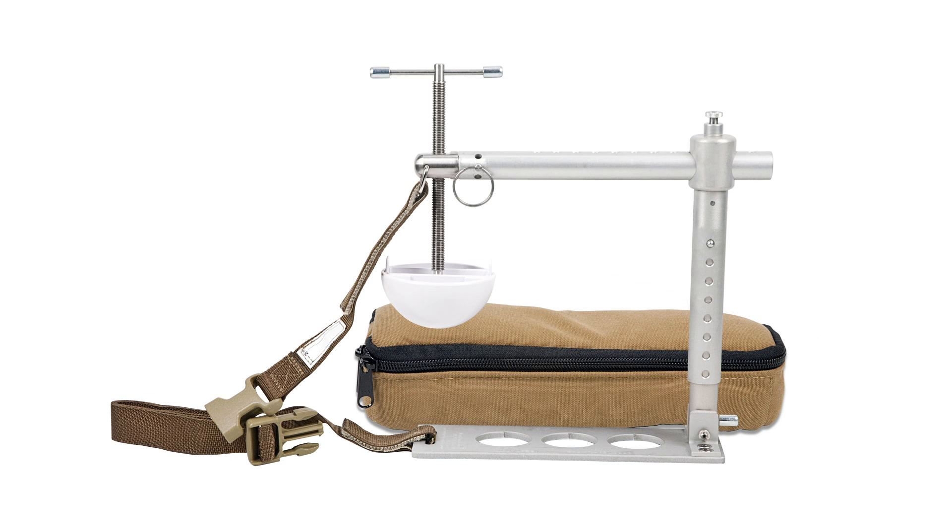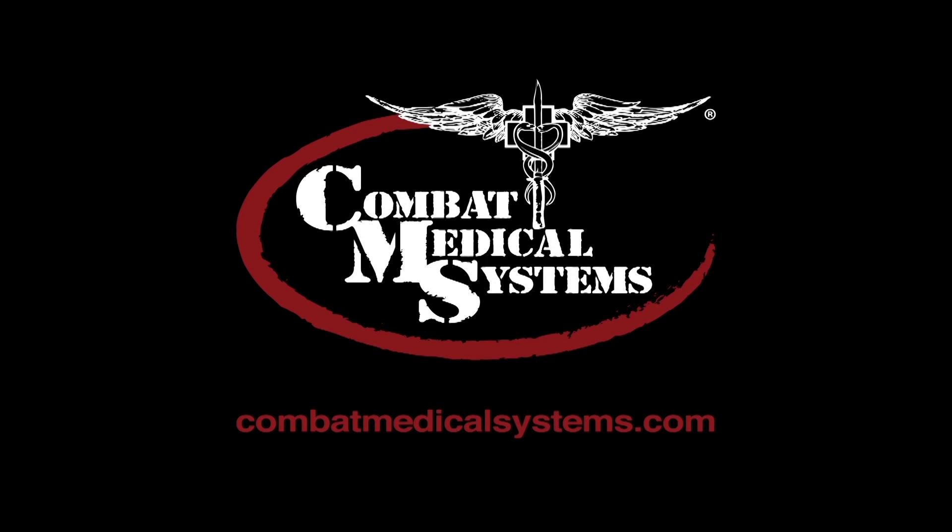Warning: the Combat Ready Clamp or Croc is not to be used for wounds to the head, abdomen, or chest. Take proper cautions when administering the Croc. The Combat Ready Clamp should only be applied by a trained military medical provider. The pressure disc is not provided sterile and is meant to be used over medical gauze. The Combat Ready Clamp is intended to be left on for up to four hours. This video and additional resources are available at CombatMedicalSystems.com.